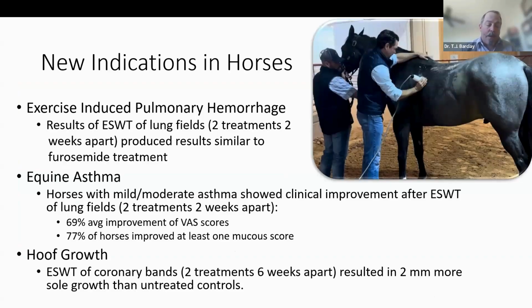And I wanted to take some time here and discuss some newer indications that have come about based on some relatively recent research that's been done. Both of these indications are in horses. And we'll start off by talking about some pulmonary indications in horses.